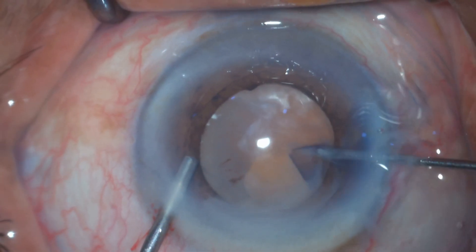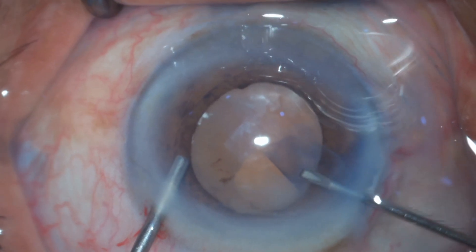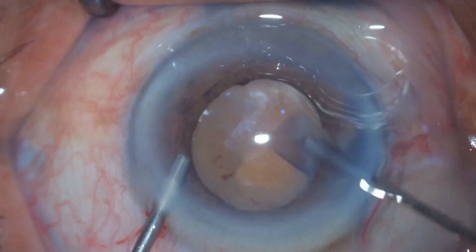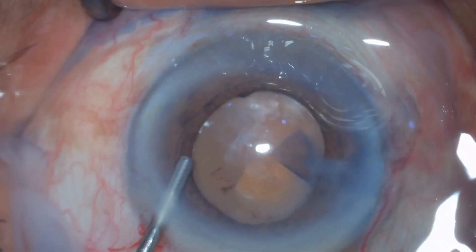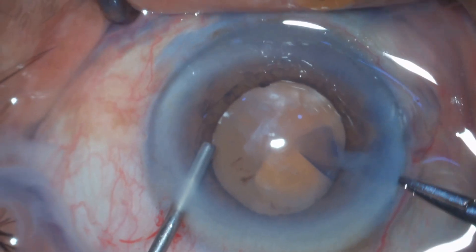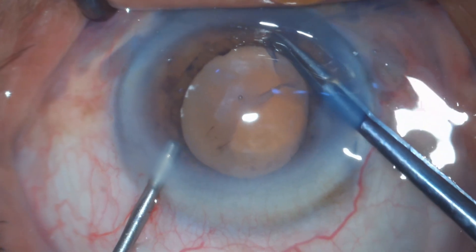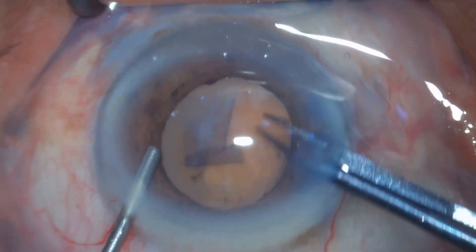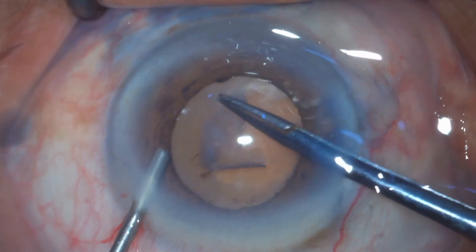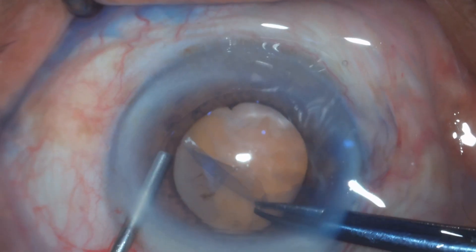I am pressing my left thumb and negotiating the intralenticular pressure with this visco-dispersive viscoelastic material, maintaining and pressurizing the anterior chamber — that's why I named this technique pressure capsulorhexis. I start the capsulorhexis with a 26-gauge bent needle and finish with a Haldipurkar forceps, as the capsule is quite fragile.